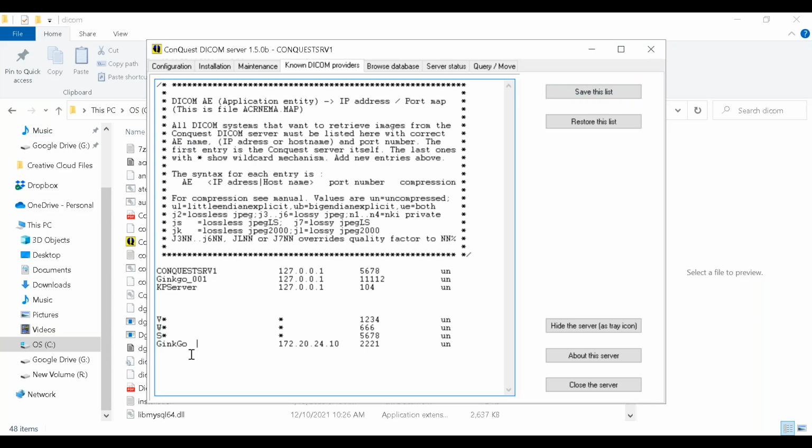Well, I know the name of the software that I'm going to use for my workstation is Ginkgo. We're just going to call ours Ginkgo. I know this is my machine's IP address, and this is just a port. I could have grabbed any port I wanted to. I basically did an inverse of this. And I know 2221 is a popular DICOM port, so I'm just going to use that one. So this is my workstation that we're going to set up here in a little bit.